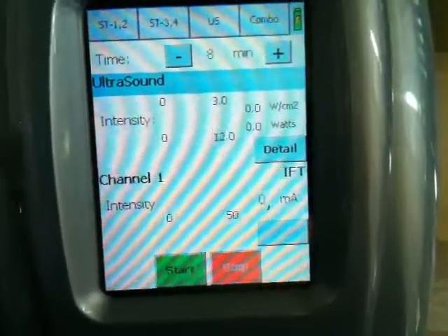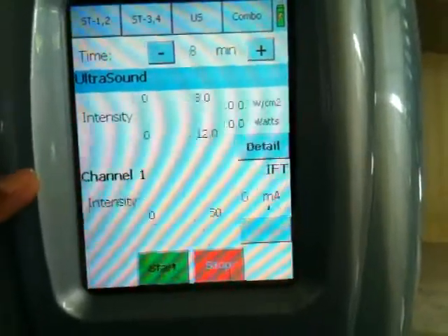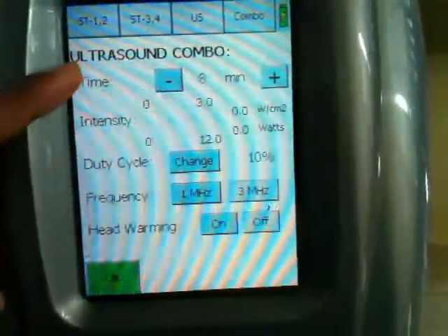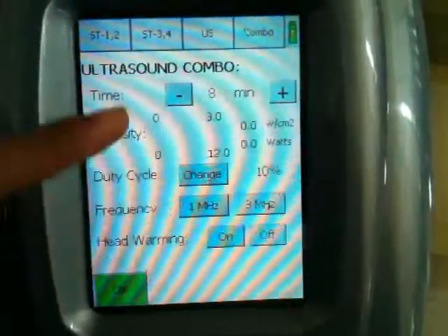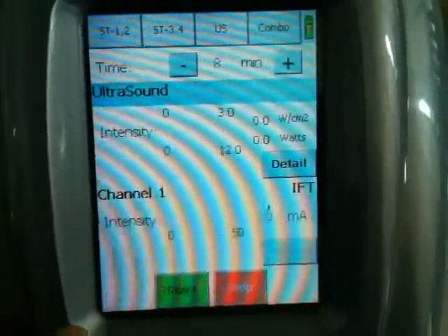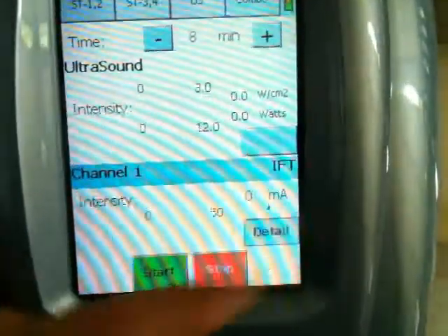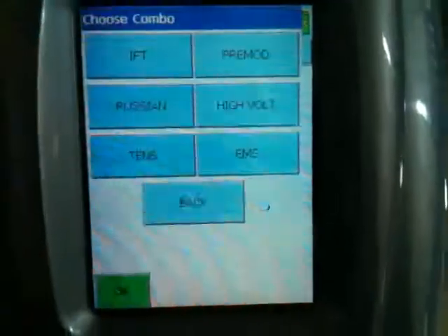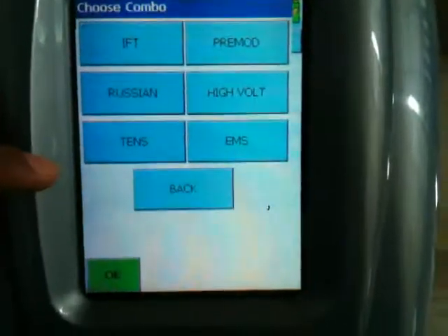In the combo section, you can detail out whatever intensity you want to choose for ultrasound. In the detail section, you can customize the ultrasound mode. Going back, you can choose in channel 1 any of the modes. By selecting the mode key, you can change to IFT, pre-mode, Russian, hi-volt, TENS, and EMS, which will be further combined with ultrasound.